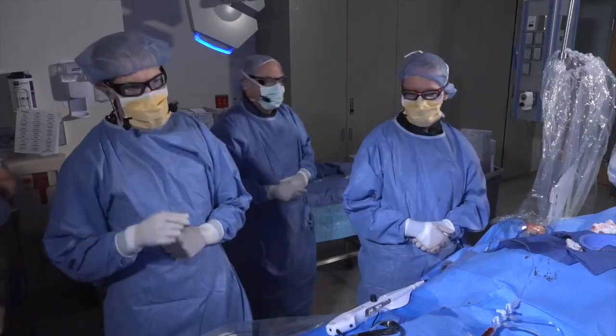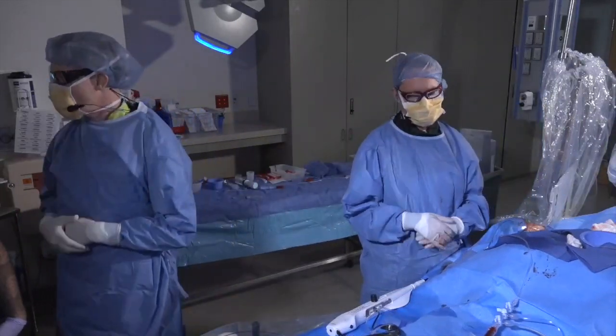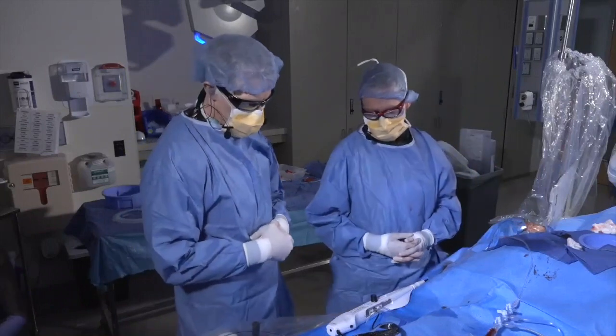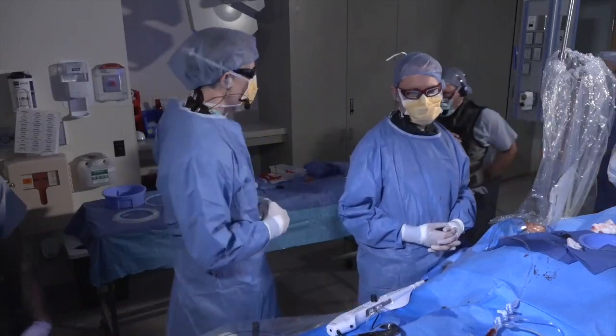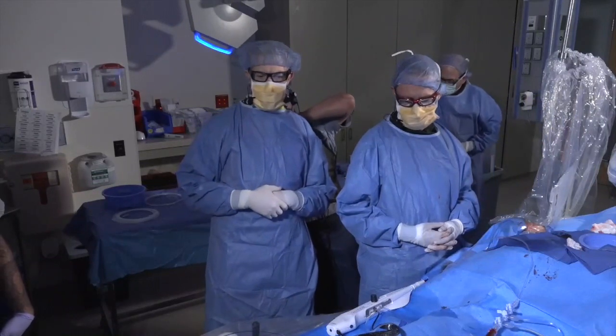use support. But in a patient that is stable, has the right coronary artery revascularized, has a left system, even though you're in the left main, you're not dealing with major bifurcations. Even with the use of atherectomy, I think you can get by without needing hemodynamic support.